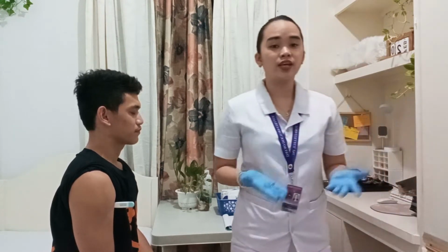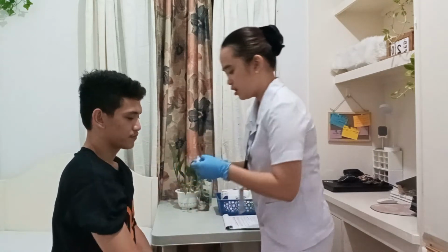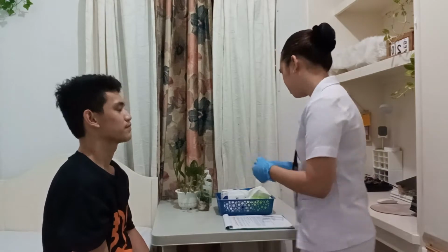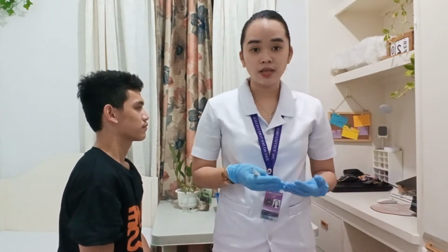Okay, now that we can hear the tone of the thermometer, it means that it is done reading the patient's temperature. Okay, your temperature is 36.2, which is a normal temperature. It is important to know also that the axillary temperature is 1 degree lower than the oral temperature.